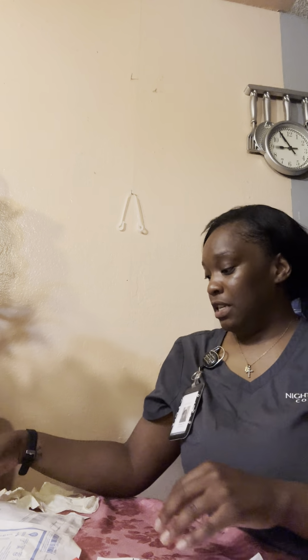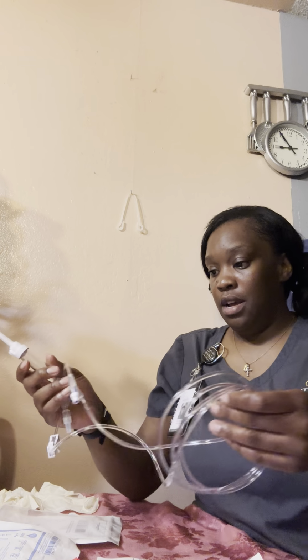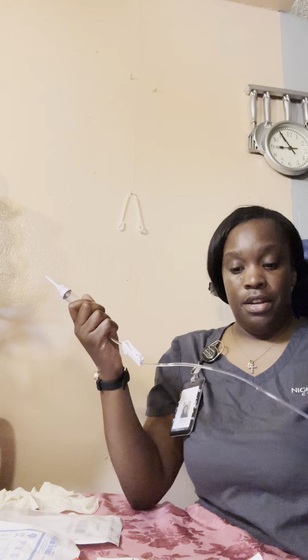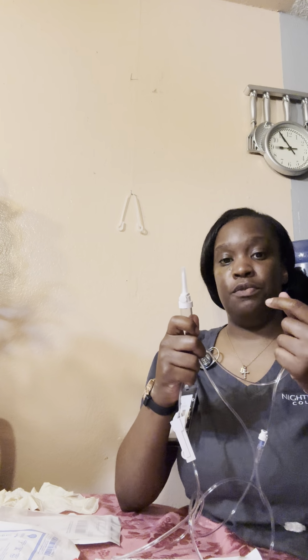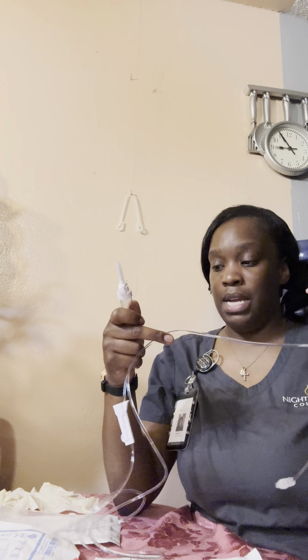All right, so next I'm going to describe the tubing that we have here. The primary will be used for the fluid. So it's a little tangled. Okay, so this is the spike, and you want to keep this cap on at all times because you want to keep it sterile, because this is what's going into the bag. So you keep the cap on until you're ready to take it off and apply it in the bag.